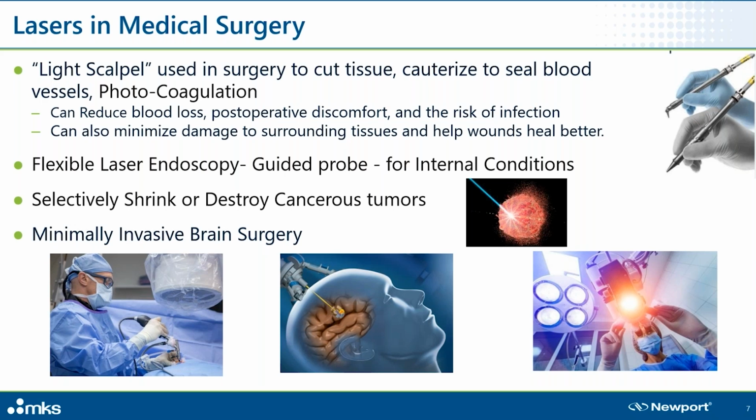In oncology, doctors are using photodynamic therapy to treat cancer. The doctor administers a photosensitizing drug to the patient. This drug is targeted and taken up by the hungry cancerous tumor. The photosensitizer is then activated with laser illumination, which converts into toxic radicals that kill the cancerous tissue.